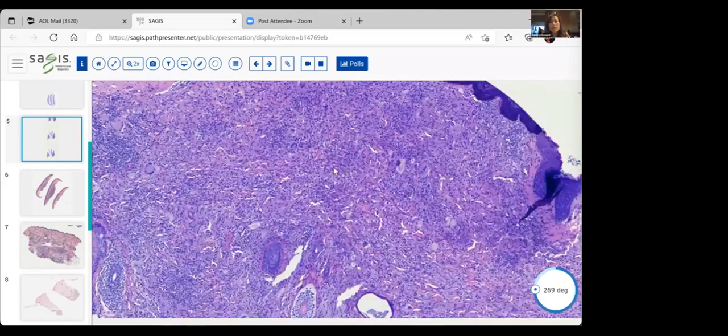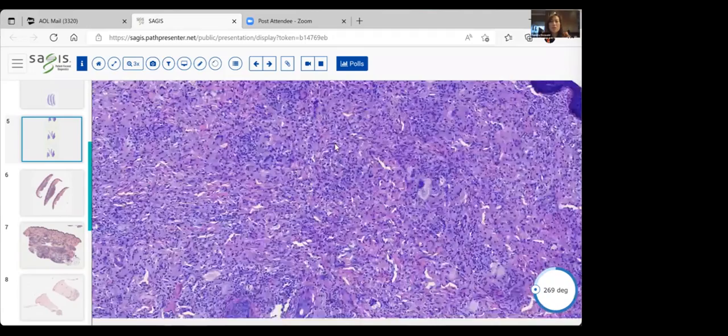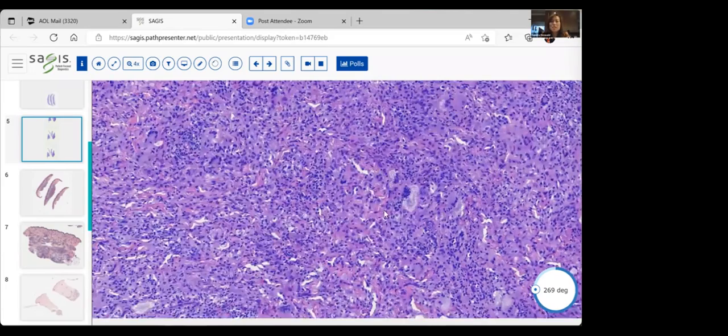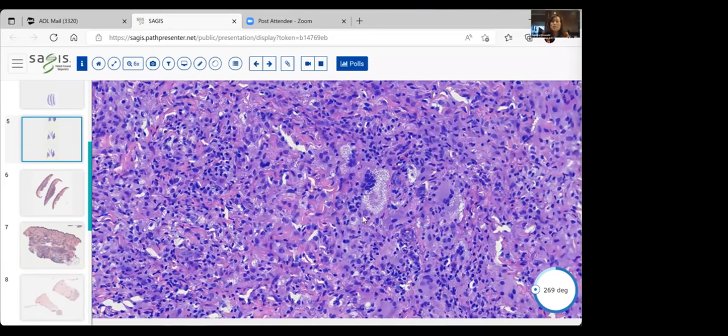And when you look carefully, you start to see mononuclear cells resembling histiocytes, but also look, foam cells again. So you can see foam cells in this entity. As a matter of fact, this entity, which is a type of xanthogranuloma, when you have a well-developed lesion, you're going to have more lipid and more foam cells. But in an early lesion, you may not have many foam cells. So it makes it much harder to know what this entity is. But again, a well-established xanthogranuloma will have more foamy cells.